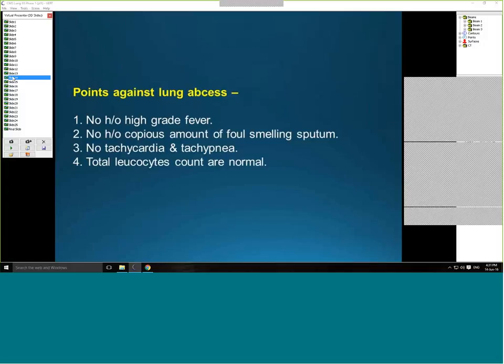Now we have to confirm that, and the students have to perform examinations to confirm that the diagnosis is that of lung carcinoma. Starting with the CT scan, students will use the Vert system to view scans of the area examined. Again, during this phase, the students review CT anatomy of the major organs. We review contrast and any allergic reactions to contrast media and what to do if a patient has a adverse reaction to contrast, since we have some centers here locally that use contrast during CT sim, and students must be aware of any possible situations that might occur.